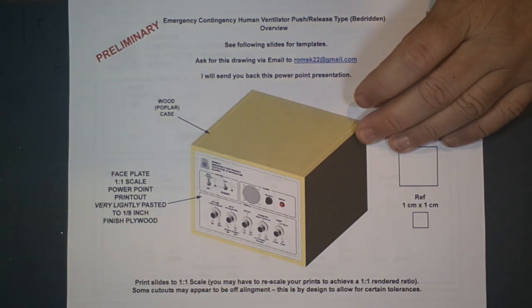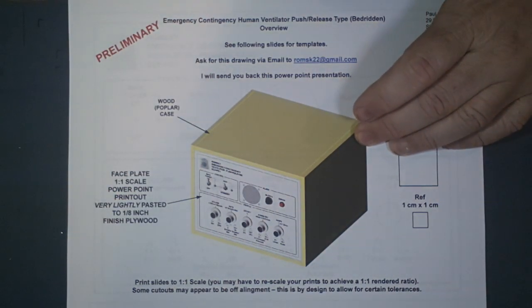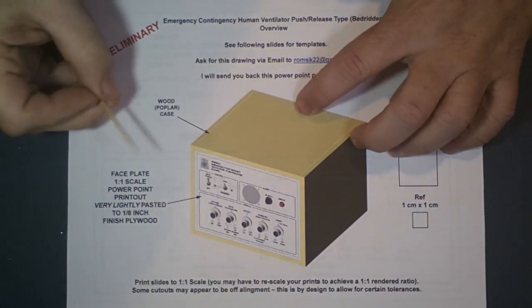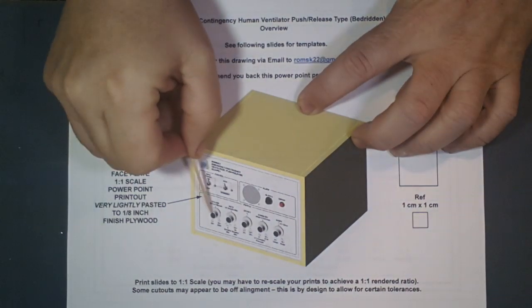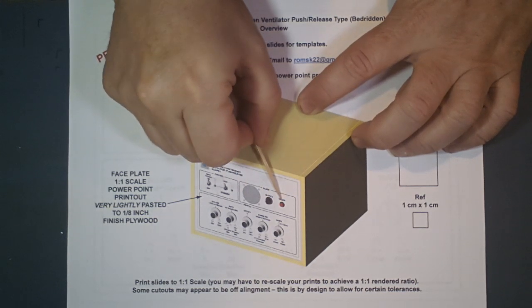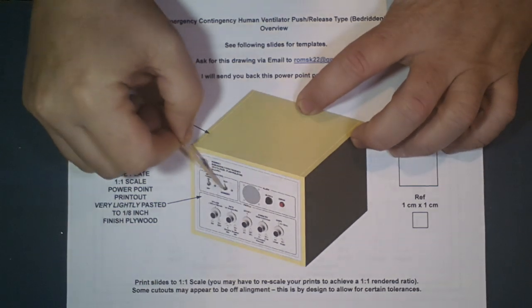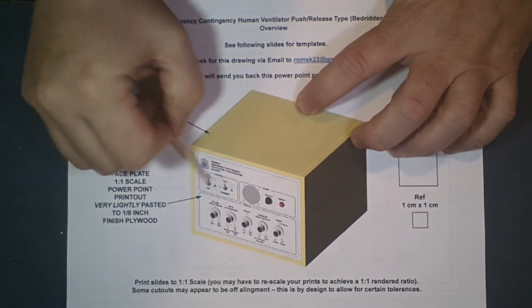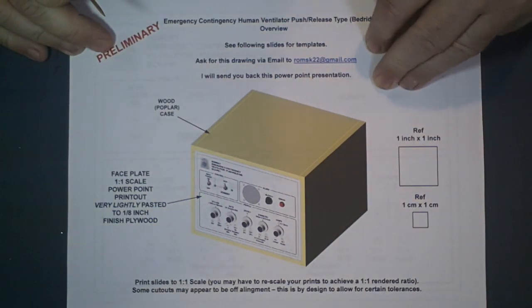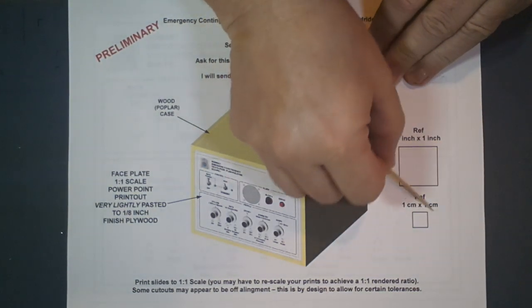It's low cost, easy to do. You don't need a big printing company or etching to put this in metal, which would be nice if I was delivering it to a customer, but for home use it works out pretty well. So anyway, you're going to see I'm going to have the controls, a speaker eventually with an alarm silence and a big red light, so if something goes wrong I can send an alarm. And since the power supplies have a standby mode and a power switch, I can just put that in there too. And when you print it out, I have a 1-inch reference when I print it out.